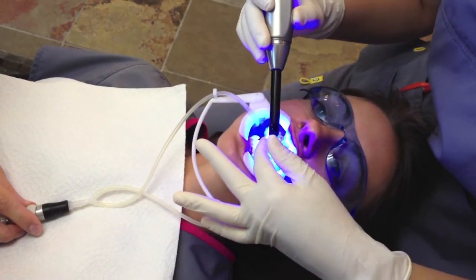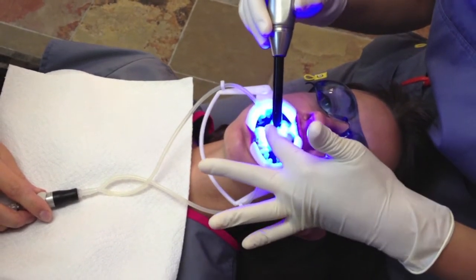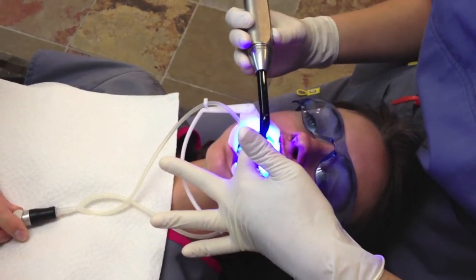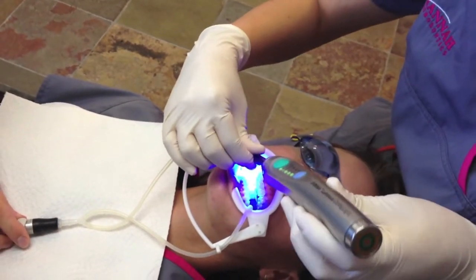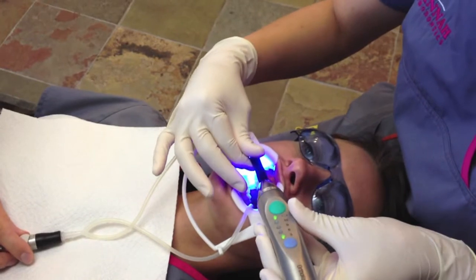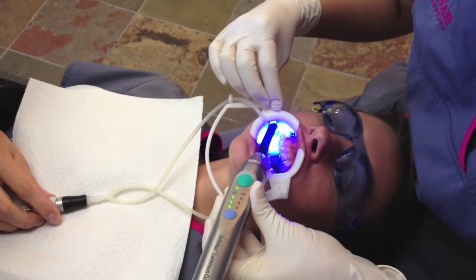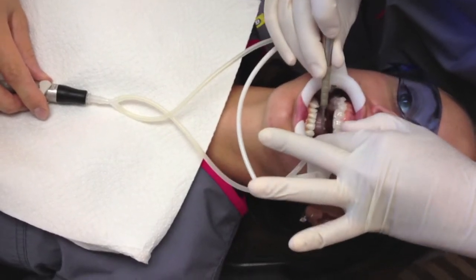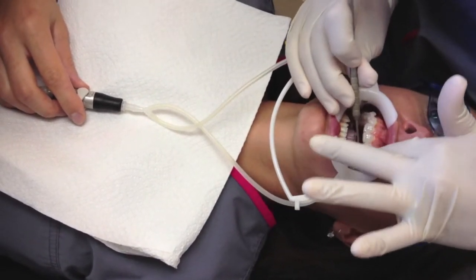We usually don't hold it for longer than two seconds or so. It's a little warm but not too uncomfortable. We cure through the hard tray first, then we take the hard tray off and there's still a soft tray under there, so we cure through the soft tray. Then we take it off and cure on top of everything else. Now the soft trays are coming off, and once they're off we're gonna shine our light one more time, take the cheek retractors out, and put the wire in. And she'll have her braces on.